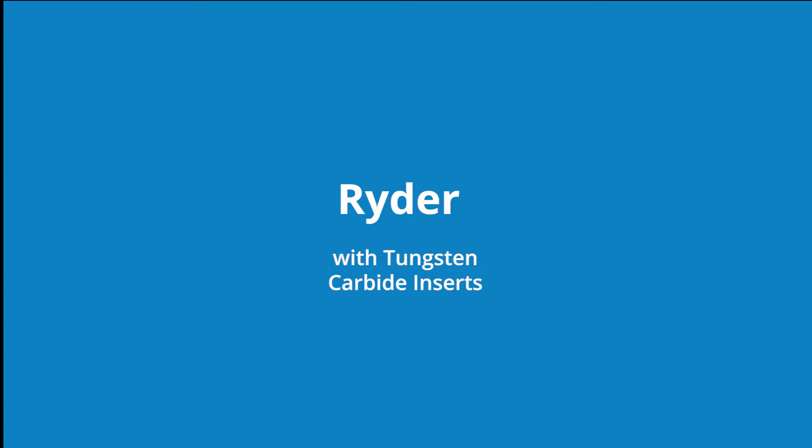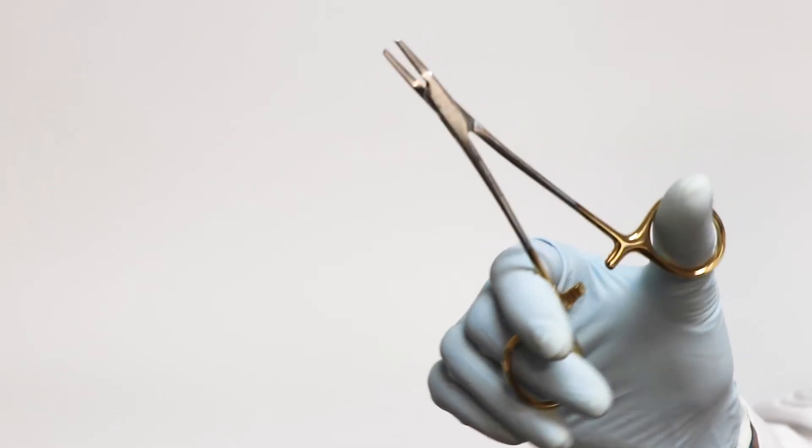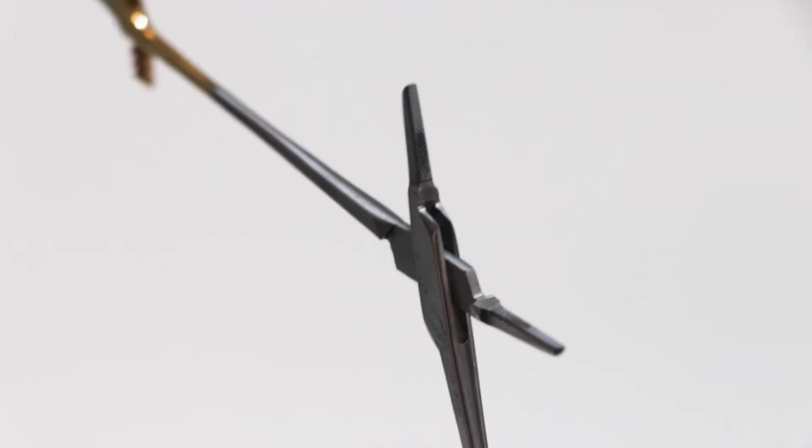Ryder needle holders have delicate tips, and they are used to hold small suture needles. The tips have a cross serrated pattern and tungsten carbide inserts.